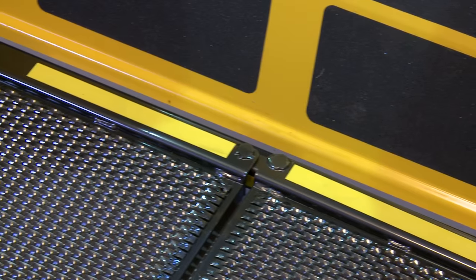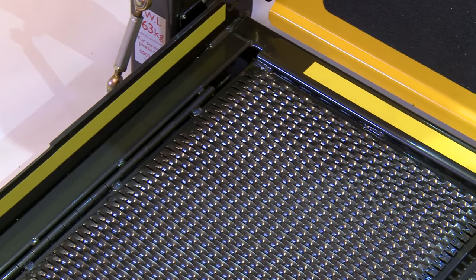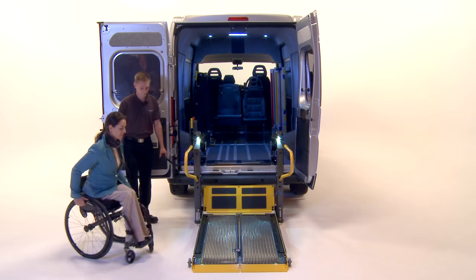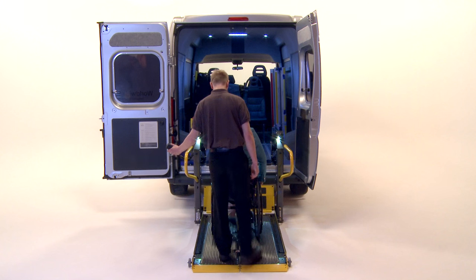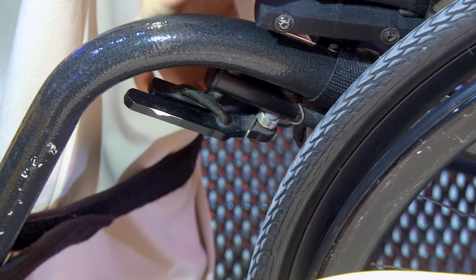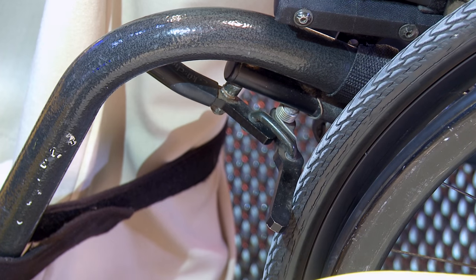All Brawnability lifts are fitted with fluorescent strips around their platforms to indicate the correct wheelchair loading position. Wheel the wheelchair user onto the lift platform, ensuring both wheelchair user and attendant are positioned centrally within the loading area. Turn the power off on electric wheelchairs or apply the handbrake on manual wheelchairs.